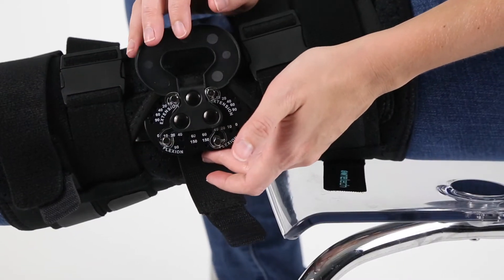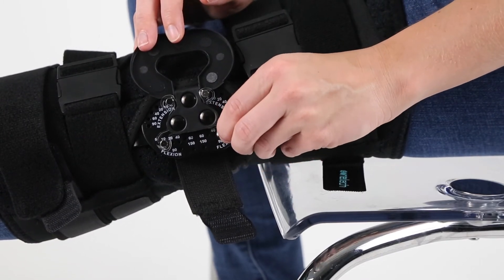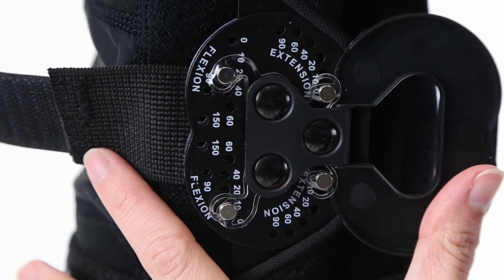A dual hinge design with extension and flexion aluminum pins permits easy on-the-go adjustments, allowing the knee to bend from 0, 10, all the way up to 150 degrees.